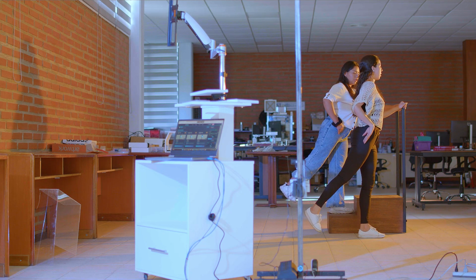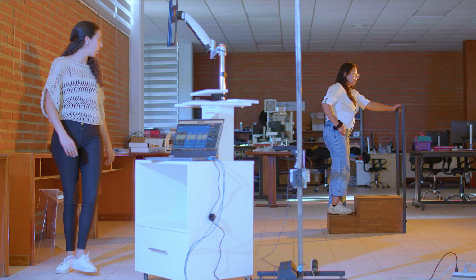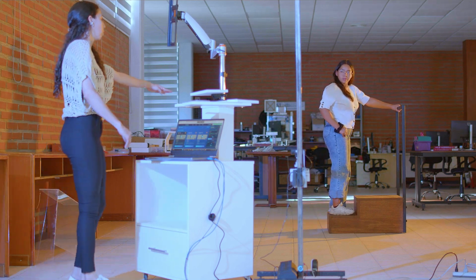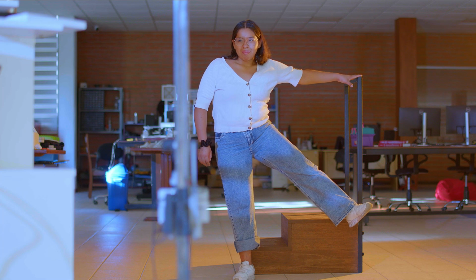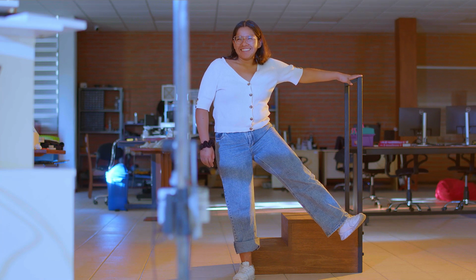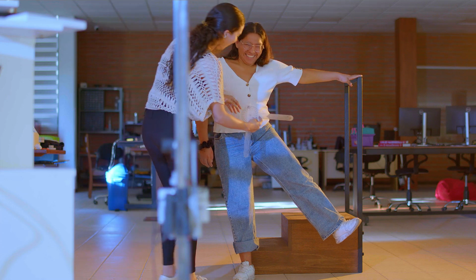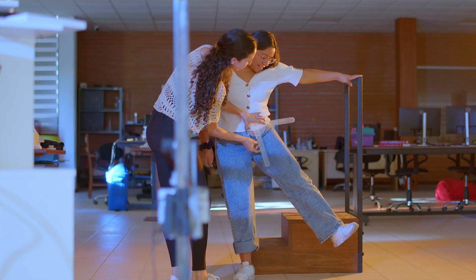The system operates in a two-dimensional plane to ensure repeatability and maintain a clear pedagogical focus. The session is started, the camera is positioned, the movement is performed, and the range of motion is obtained in real time. At the end, the report is supported with evidence of the practice.